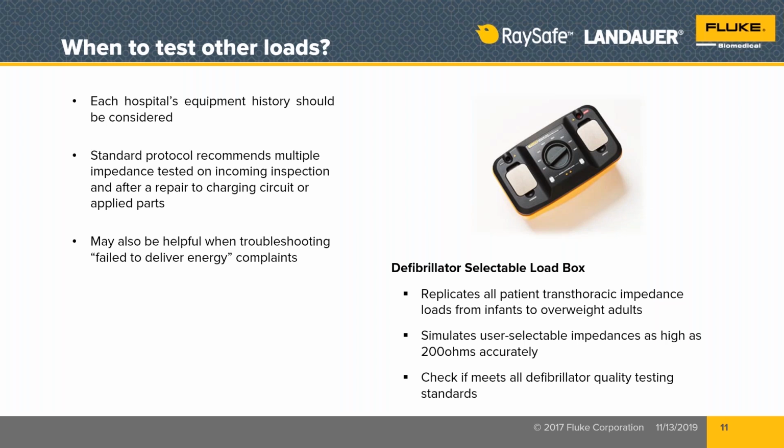Trust, but verify. You need to see for yourself that this functionality is working properly. It may have been tested at the factory by the manufacturer you bought it from, but you need to see it for yourself, objective, independent evidence that this functionality is working. How about after repair? So sometimes if you're not doing the repair in-house, it's going out and coming back in. So that's another instance of the acceptance test.